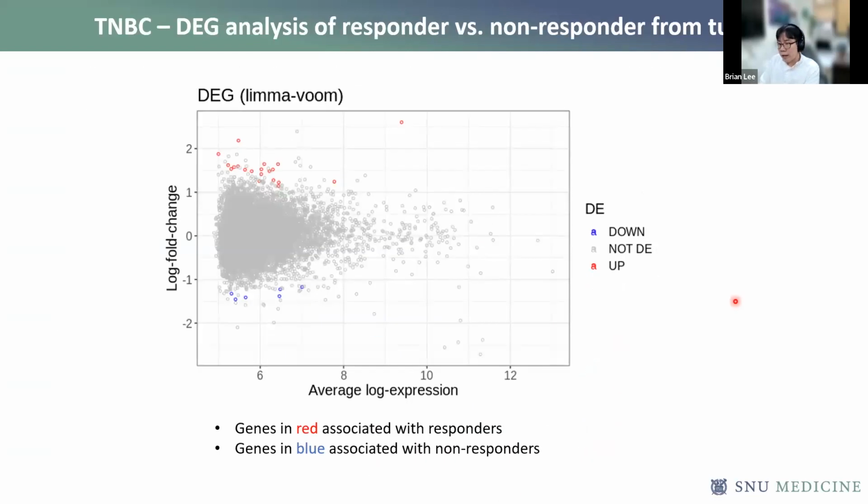And so after collecting these ROIs from the respective images, we subjected these to differential expressed gene analysis. And so we wanted to compare the gene sets between responders and non-responders. And so while I won't be able to show exactly which genes they are today, we've generated a gene signature that can help predict whether these patients will respond or not respond to ICB treatment.